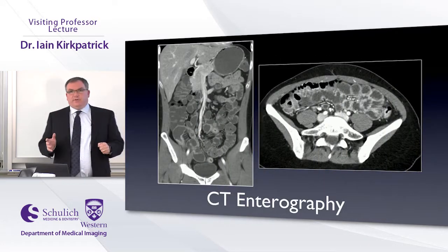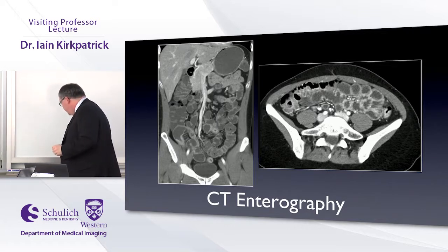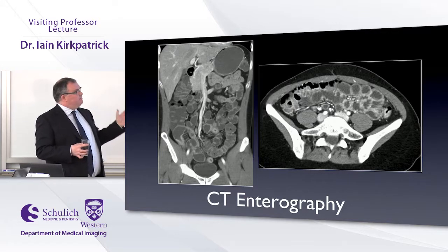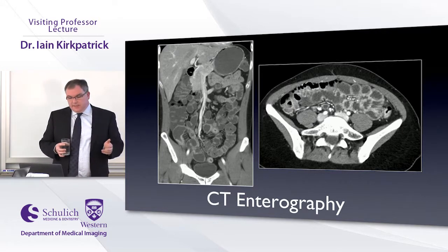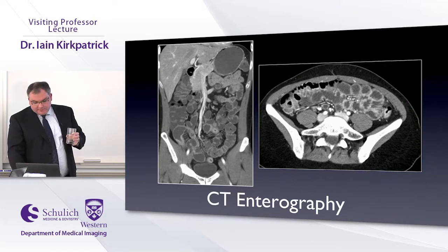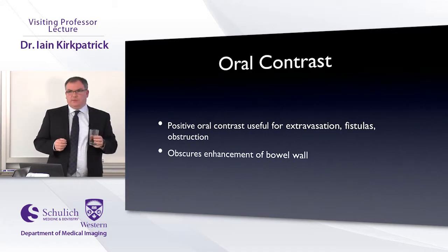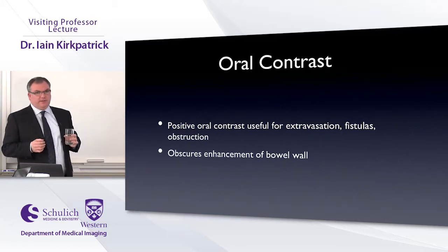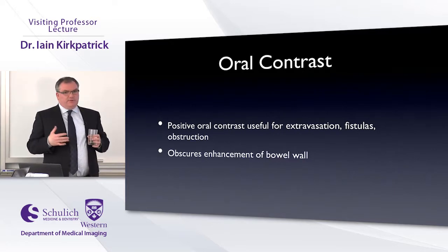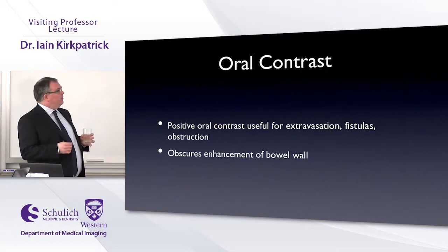And then for the last part of our talk, I want to move into CT enterography. So we do a lot of these. We probably do 3-4 a day most days, sometimes more. Ten years ago, most of our abdominal CTs, we were using positive oral contrast. In fact, that was the norm. These days, we've definitely moved away from that. We don't give very many people positive oral contrast.